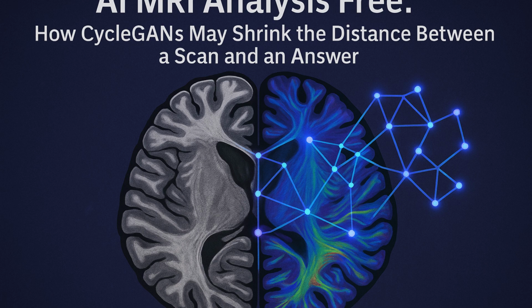Gotcha. But the immediate potential benefit, where could that be? Well, as the paper suggests, maybe in resource-limited settings. Like rural hospitals? Exactly. Places where maybe they don't have the newest scanners or the expertise for diffusion scans. Or it's just too expensive or time-consuming. Right. In those cases, even a good approximation of an FA map from a standard scan could be really valuable. Transformative, even. Okay, so that widens access to advanced insights.